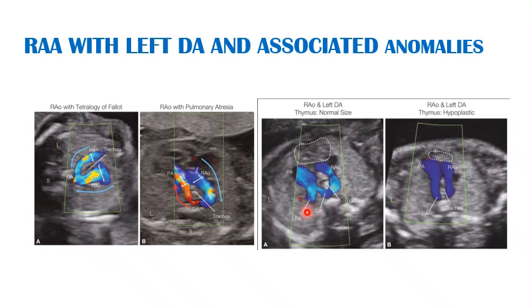Here, no chromosomal abnormality was detected in the fetus. But in this fetus, the thymus is hypoplastic with both aortic and ductal arches seen very close to the sternum. Chromosomal abnormality detected was 22q11.2 microdeletion.